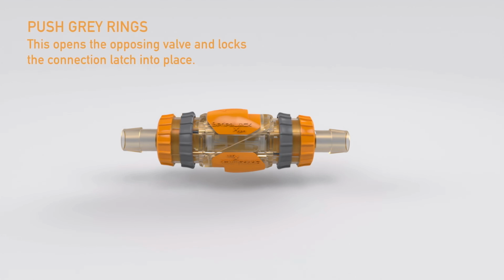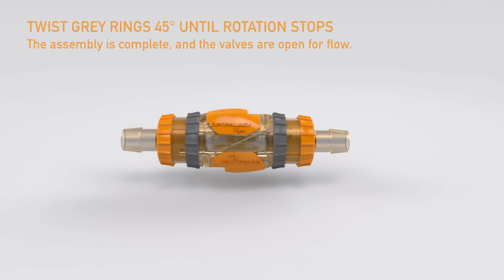Push the gray rings toward the center. This opens the opposing valve and locks the connection latch into place. Finally, twist the gray rings clockwise with a 45-degree rotation until rotation stops to lock. If rotating both rings at the same time, each hand twists in opposite directions. The assembly is complete, and the valves are open for flow. Orange button latches are locked when valves are open as a safety feature.